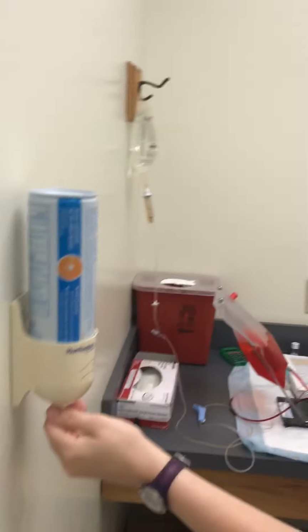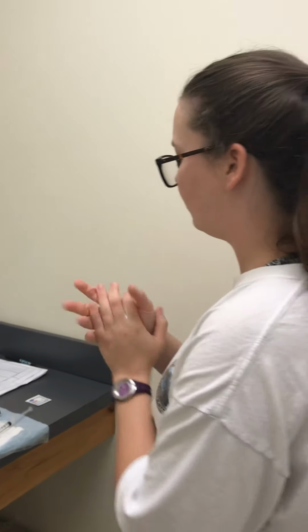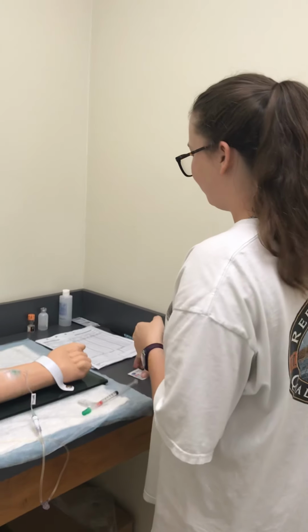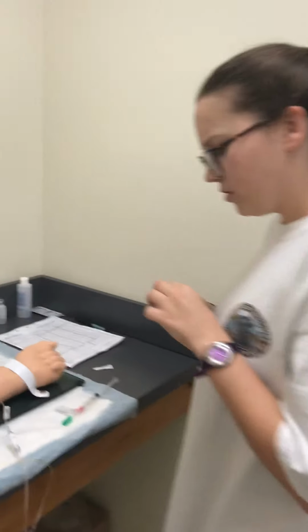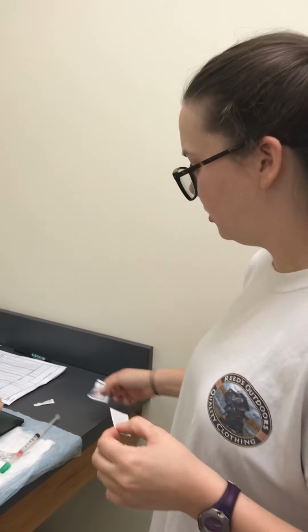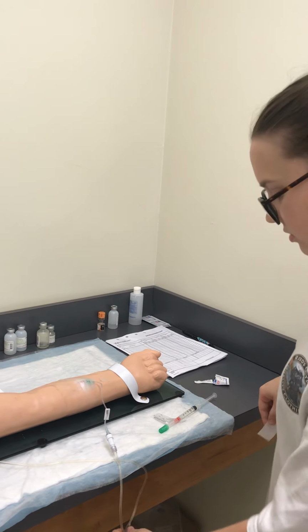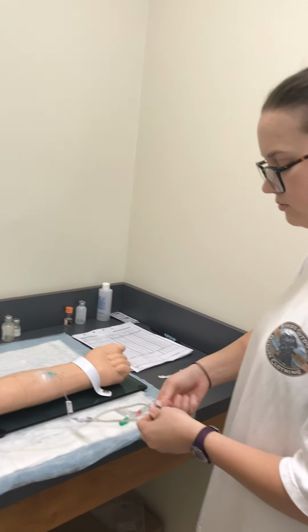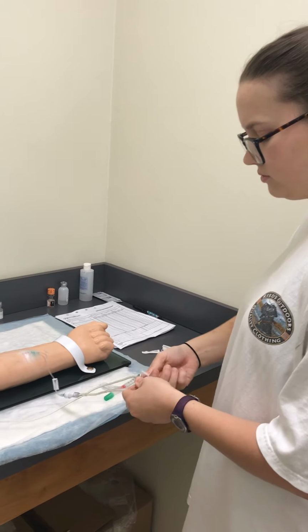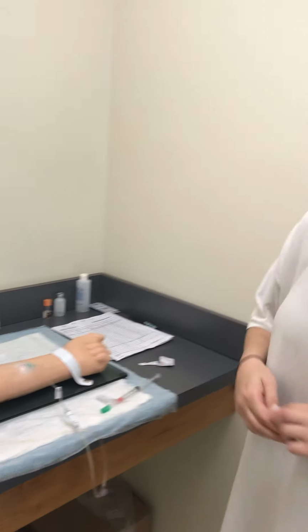Now before I begin, I'm going to wash my hands. I'm going to scrub the hub closest to the patient. Seconds and allow to air dry.